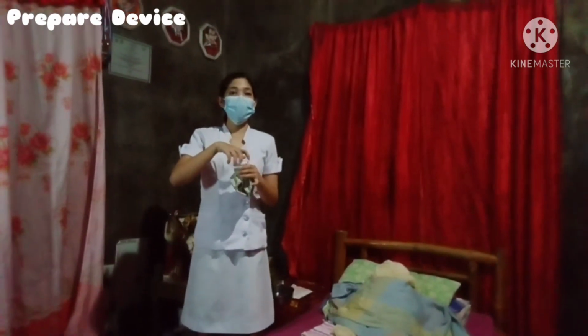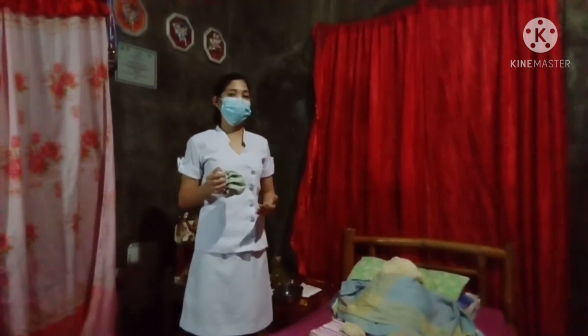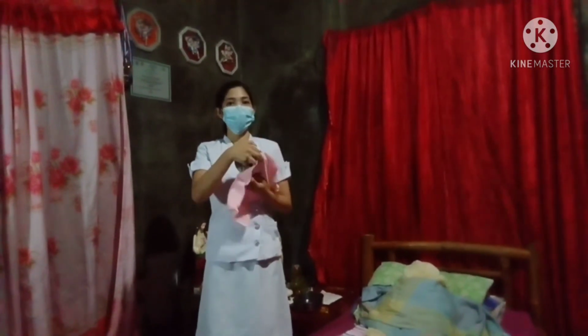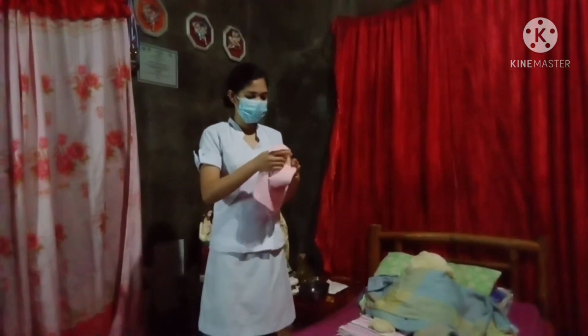We have to remove any excess air from the device and securely fasten the end of the bag or collar. Tie the glove closed, checking for holes and leakage of water. And also prepare commercial ice packs if appropriate. Ice provides a cold surface and excess air interferes with the cold conduction, and fastening the ends prevents leaks. We have to cover the ice bag with a towel or washcloth to protect the skin and absorb condensation. Like this.